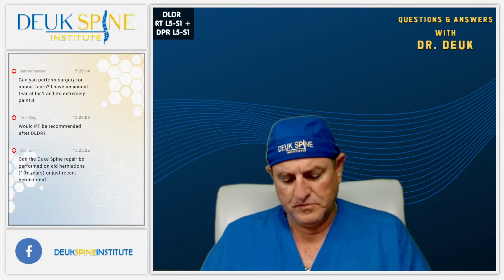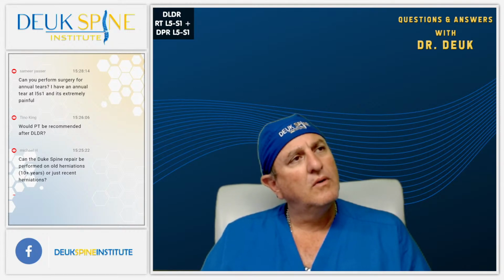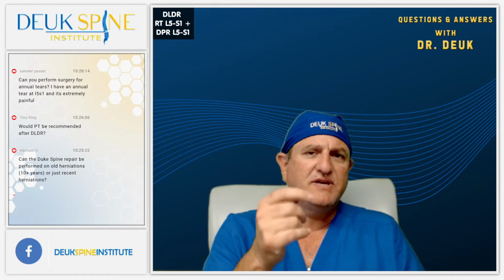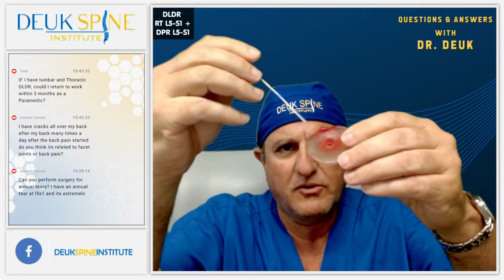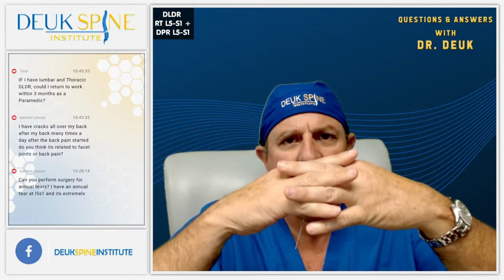And last but not least, from Samir on YouTube, they ask, can you perform surgery for annular tears? I have an annular tear at L5-S1 and it is extremely painful. Yes, Samir, you are right. Your annular tear at L5-S1 is the cause of your pain, and that is exactly what we're doing surgery for. I will go in with the laser and clean the tear.